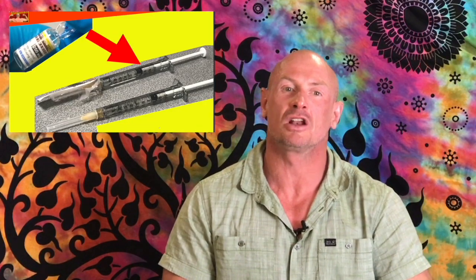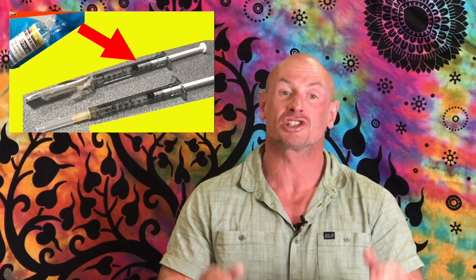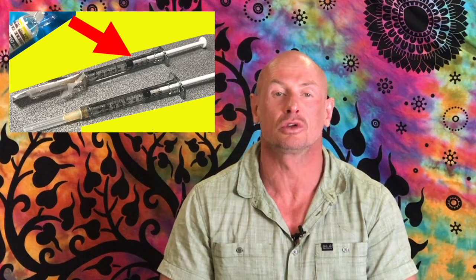Is it possible to split glass ampoules and store syringes filled with testosterone without getting unsterile? How to split and store a glass ampoule of testosterone for testosterone replacement therapy?